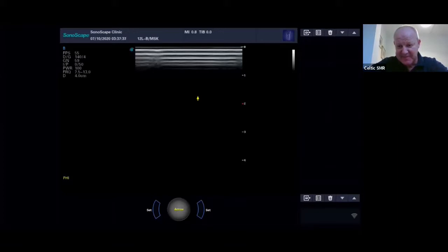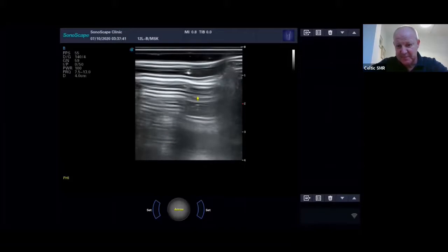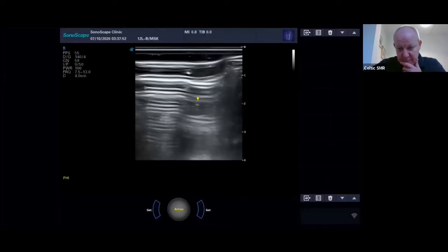Okay, so what I'm going to do then is go through what I normally do for a full shoulder exam, and then if any questions come up, we can get them. As I said, I usually stand behind the patients and scan them that way, especially if you're doing them all day. Do you think you might want to actually try that? Because I might be able to get a better image. Let's swap our positions.